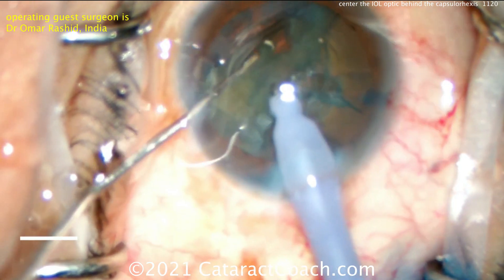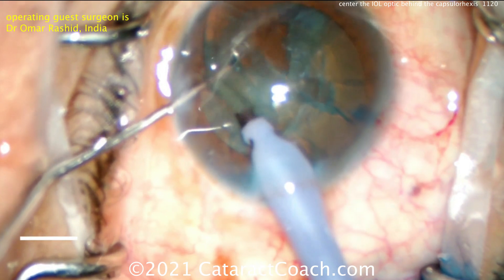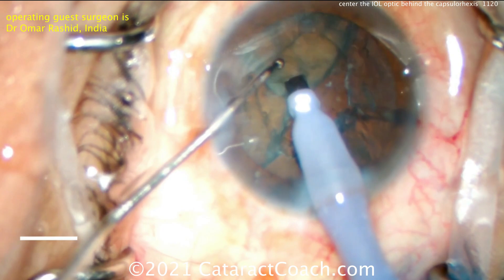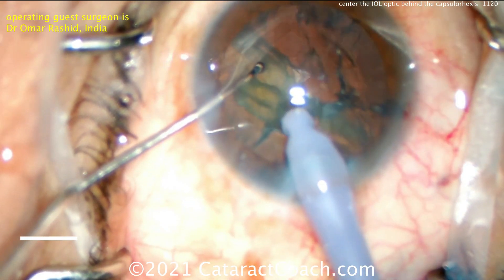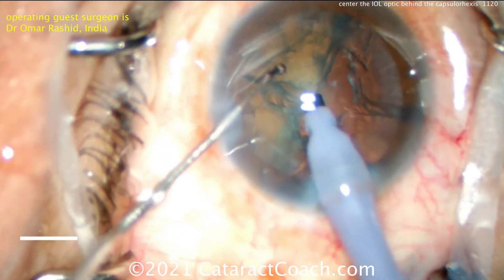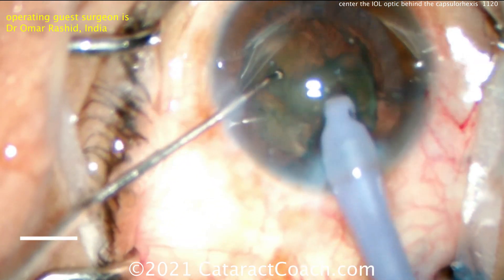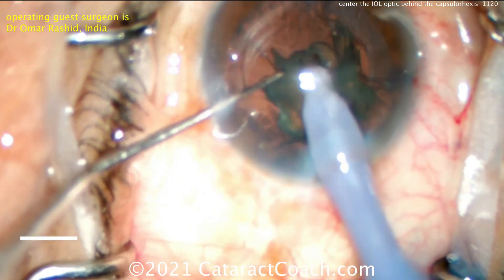The video is slightly out of focus because the surgeon is probably young with a tremendous amount of accommodation — I'm jealous. Now breaking up that other quadrant into two smaller pieces. Very good technique. What I like most about this technique is the control — there's a lot of control here, very careful, very meticulous. You can tell the surgeon is in control of the whole case.